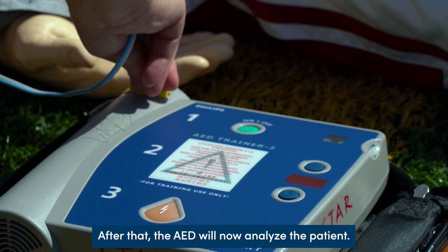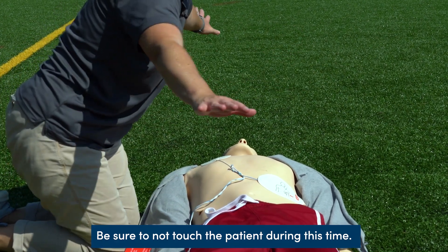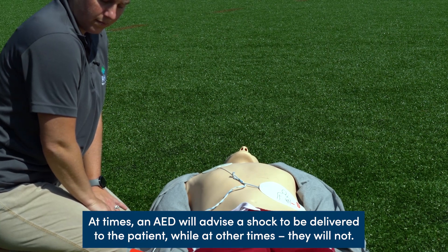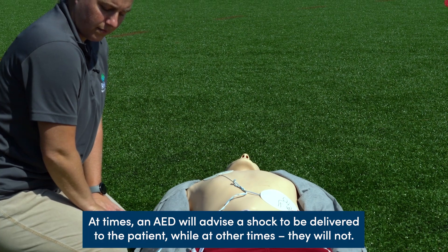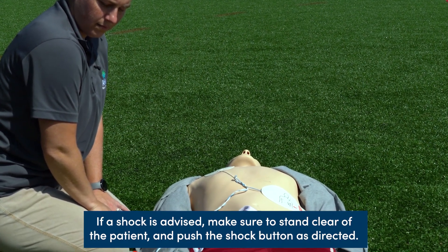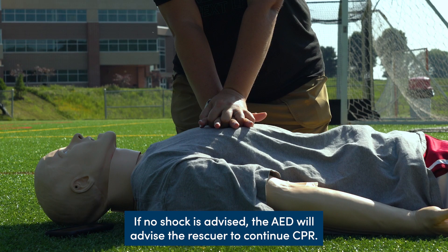After that, the AED will analyze the patient. Be sure not to touch the patient during this time. At times an AED will advise a shock to be delivered, while at other times it will not. If a shock is advised, make sure to stand clear of the patient and push the shock button as directed. If no shock is advised, the AED will advise the rescuer to continue CPR.